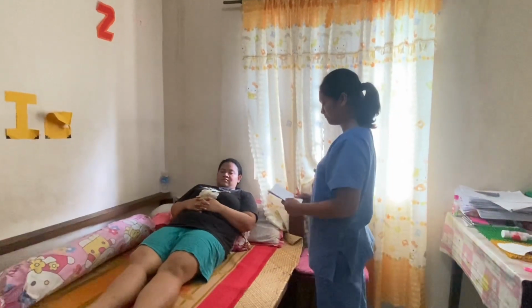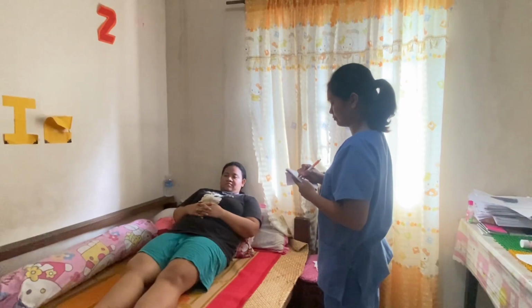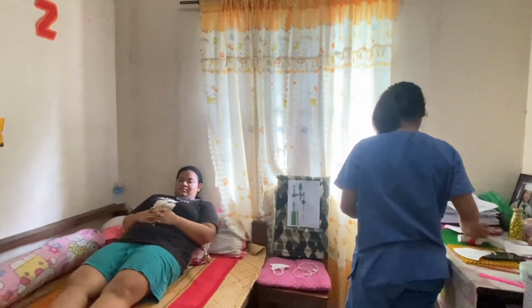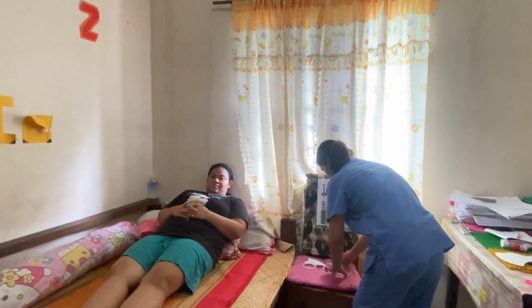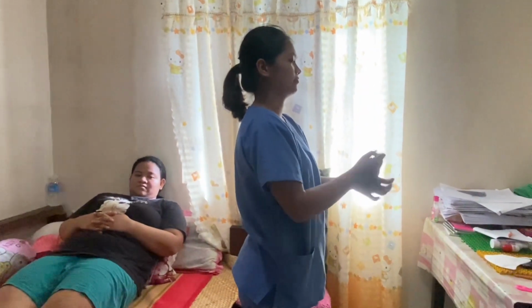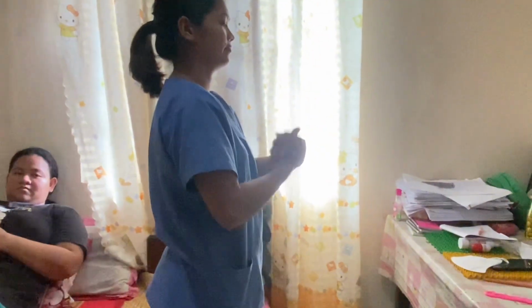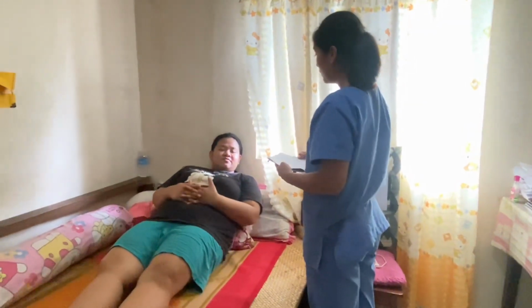Let's assume that before entering the client's room, verify the doctor's order. Then after verifying the doctor's order, gather the equipments needed while doing this procedure. And after that, perform hand hygiene for at least 10 to 15 seconds. Then after performing hand hygiene, identify the client using two identifiers.